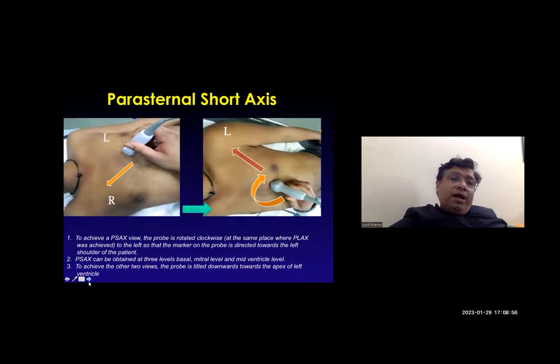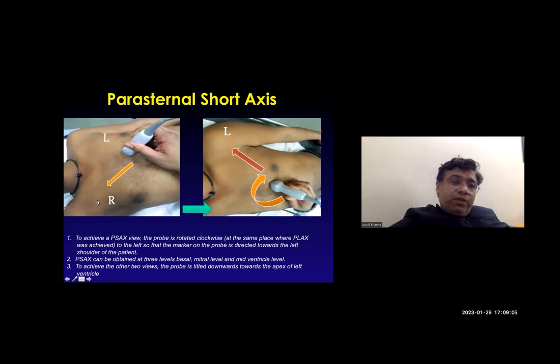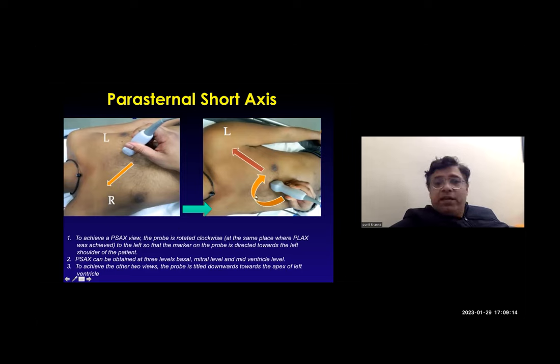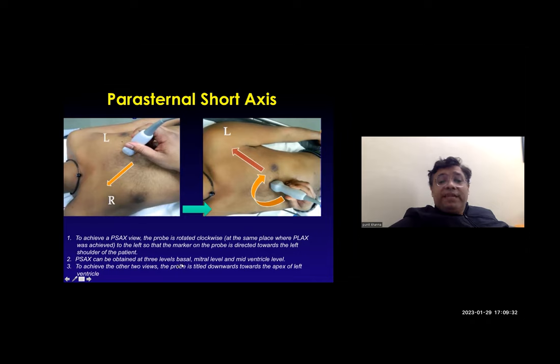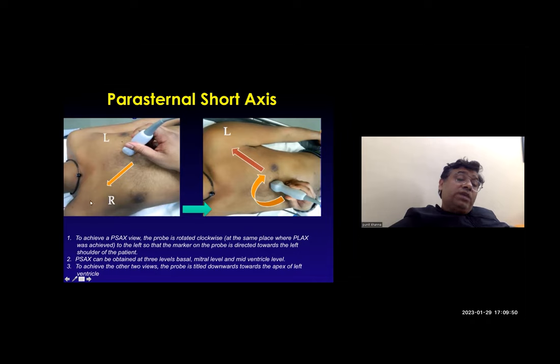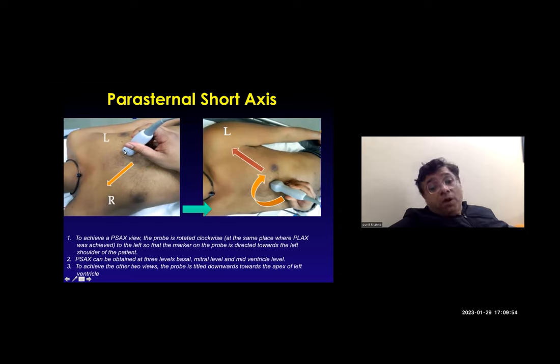Moving on to the parasternal short axis view. To achieve it, the probe is rotated clockwise at the same position toward the left so that the marker on the probe is directed towards the left side of the patient's shoulder. Parasternal short axis can be obtained at three levels: basal, mitral, or mid-ventricular — also called aortic, mitral, and papillary muscle level. The probe is tilted downward towards the apex of the left ventricle.